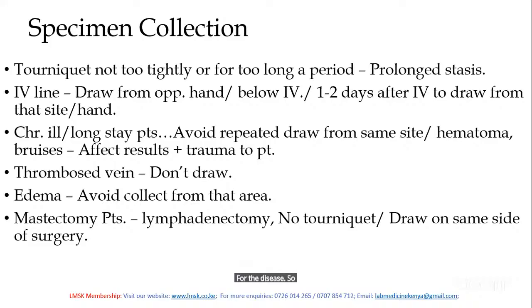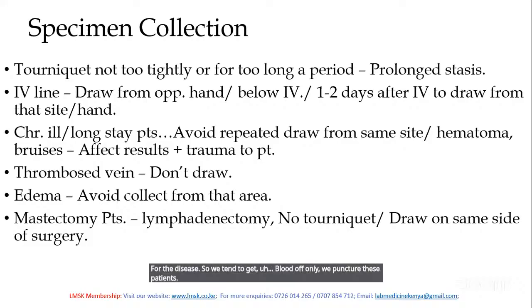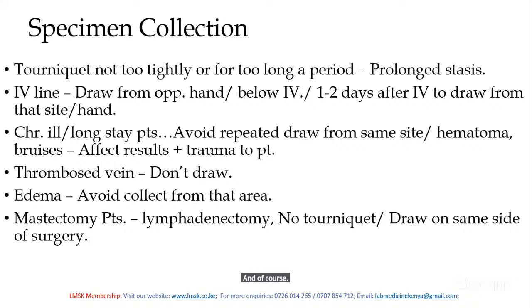So we puncture these patients often. And of course, multiple punctures can result in bruises or a hematoma. So for those kinds of patients, avoid repeated draws from the same site.